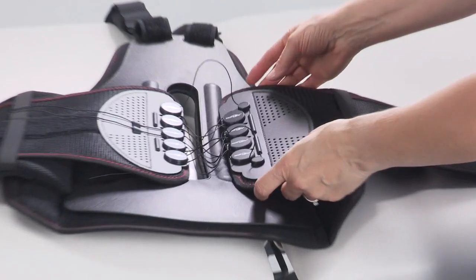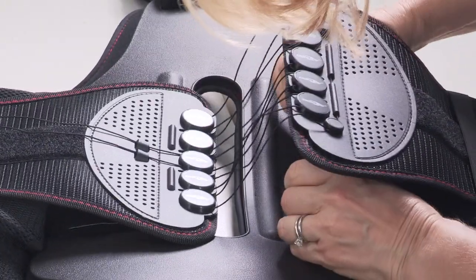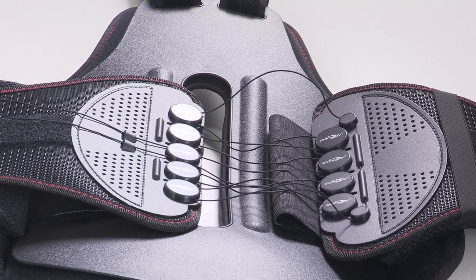If needed, to modify the waist belt, adjust the side panels by unhooking the Velcro on the back panel and moving panels more center for a smaller waist or closer to the edge of the back panel for a larger waist.